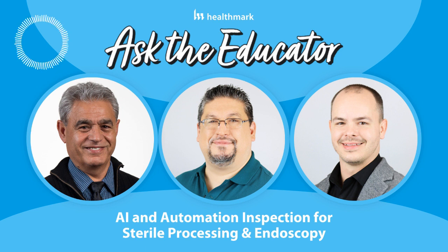And I think in the old days, visual inspection was good enough, right? We just looked at it with our naked eye and said, okay, that looks clean, let's move it along to the next step. But we know now there's too much science and too many studies that have been done. We know that's not good enough now. So we need these enhanced visual inspection methods, right?